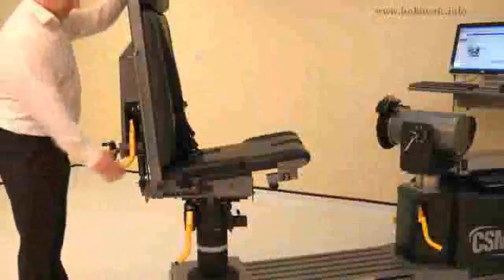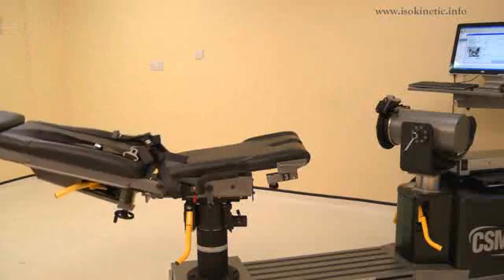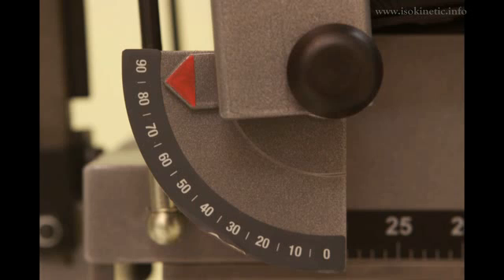To set the chair back angle, lift the locking handle and adjust the chair back. Adjust the chair back angle to 85 degrees. Ensure both locking handles are pushed down to secure.